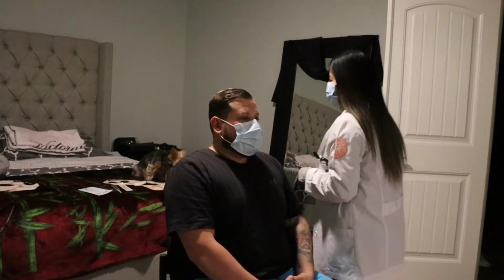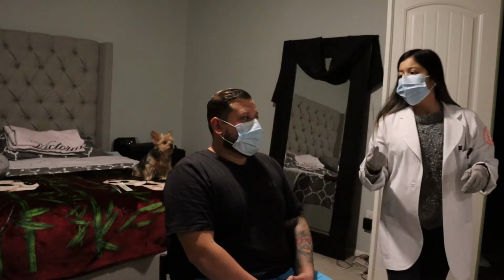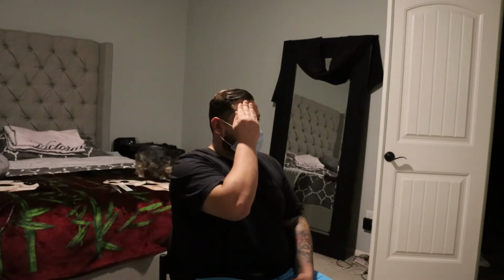Now I'm going to test your visual acuity. I'm going to use the Snellen handheld chart. Okay. So I'm going to stand 6 feet away from you. And then I want you to cover your right eye and read the smallest line that you can read. L T F P H.